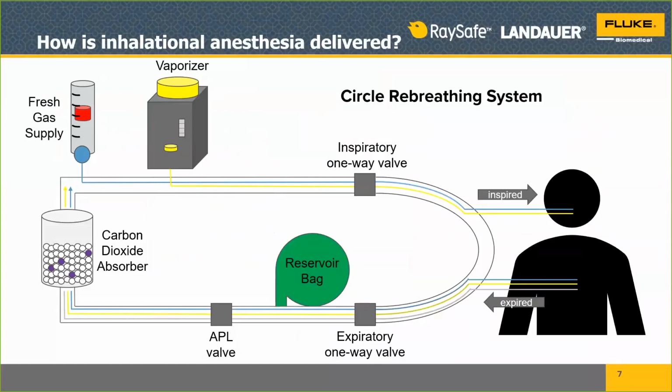And then when they exhale, they're going to exhale some leftover oxygen that wasn't metabolized by the body, sevoflurane that wasn't metabolized by the body, and CO2. So what's going out of the body is different than what's coming into the body. The expiratory valve will then open so that it pushes the three gases out and pulls in oxygen and sevoflurane for the next breath. So once it passes the expiratory valve, it'll go into the reservoir bag.